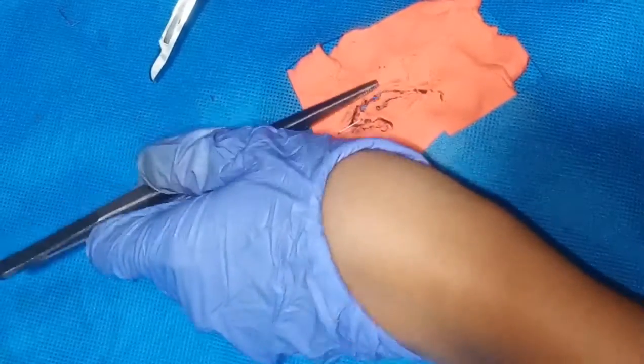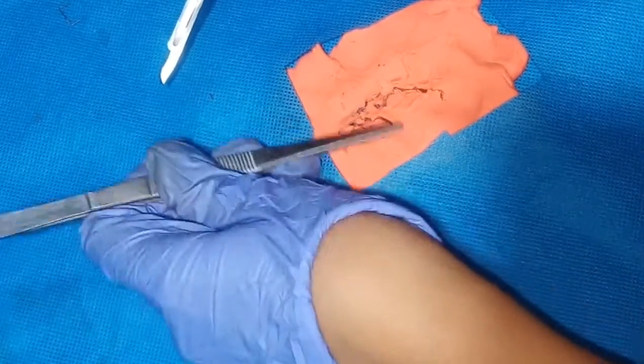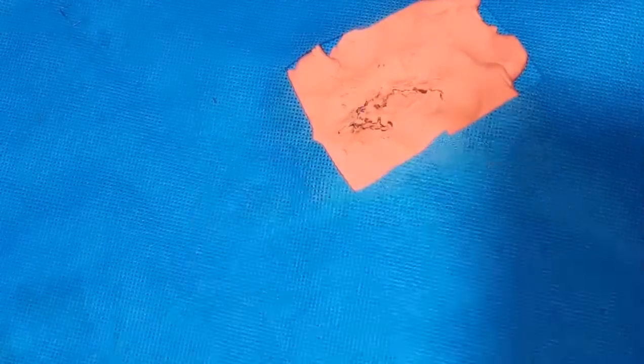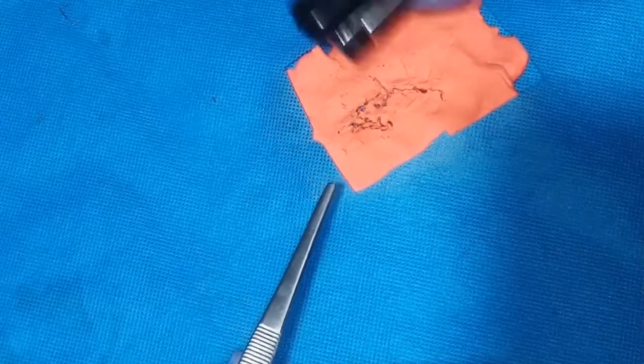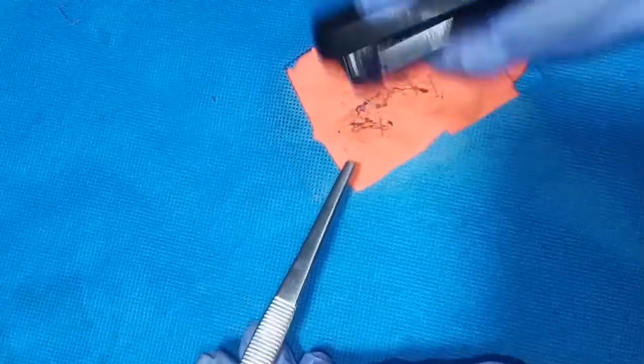According to Saunders, we can also use skin staples. Upon using surgical staples, this will serve as a stay suture or fine skin hooks when elevating the flap to avoid causing excessive damage on the skin. Here is the finished product of our rotation flap.